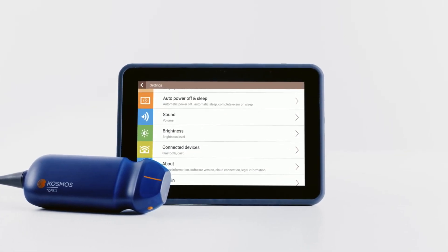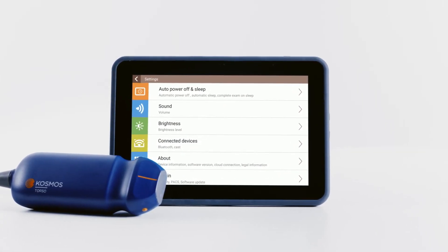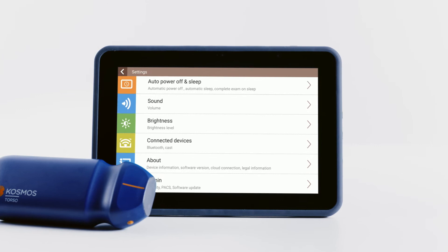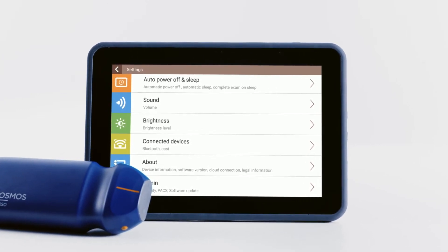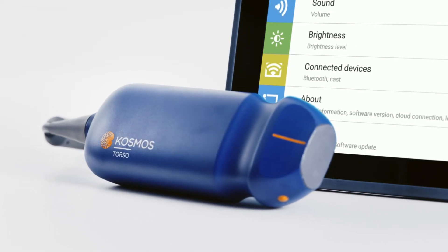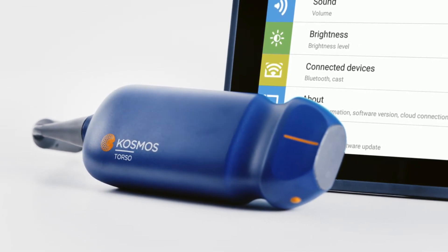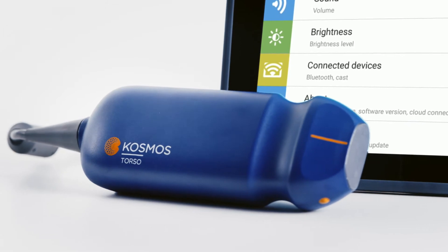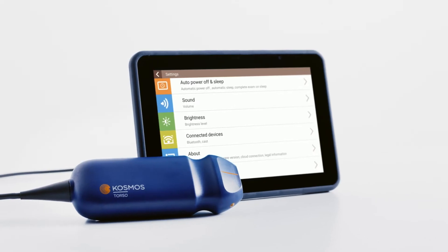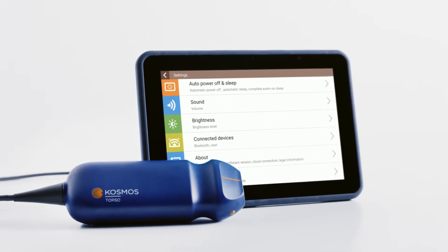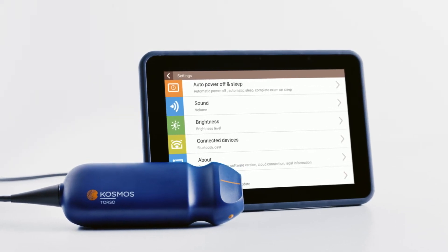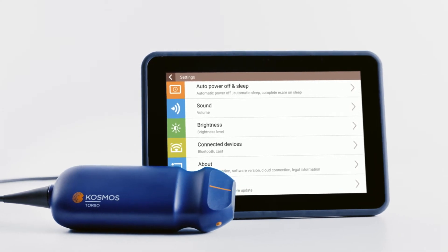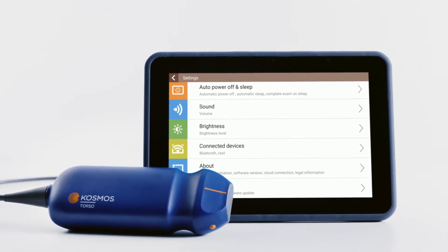Get the most out of your Cosmos by integrating it with your health information system. To get started, make sure your Cosmos is connected to the same local area network as the PACS system. One simple way is by connecting the Cosmos bridge to the same wireless network as the PACS.